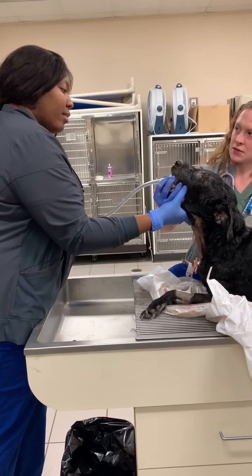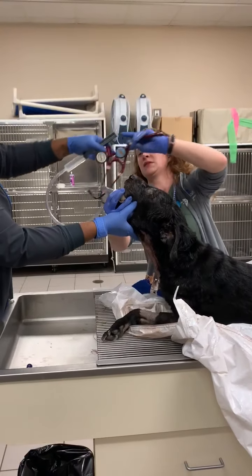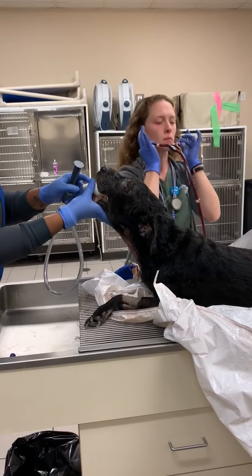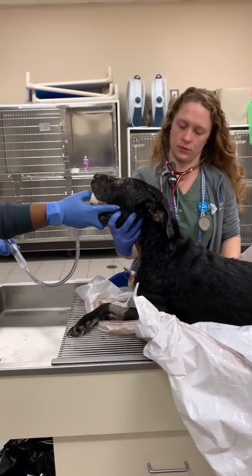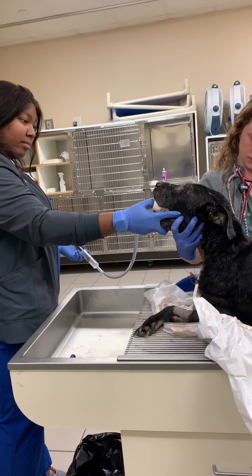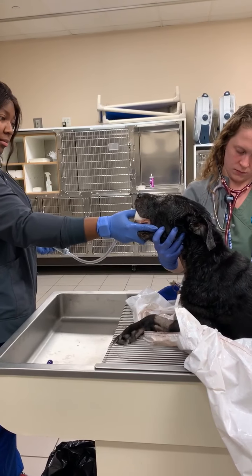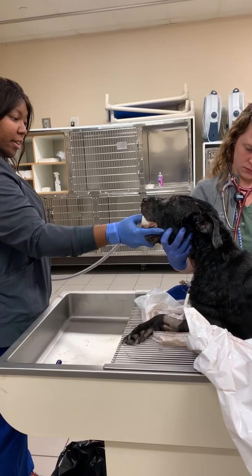I'm going to put my stethoscope. You can use it on your own, because I can wash it off. I got it. So I am going to slowly inject.